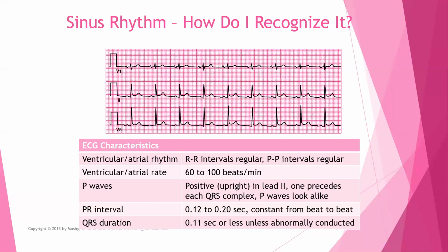So remember, sinus rhythm, the name says it all. That's the name we've given to a normal heart rhythm. It's sometimes called regular sinus rhythm, sometimes normal sinus rhythm, just sinus rhythm as well. And that represents normal electrical activity, right? So that conduction that is initiated at the SA node heads down through that normal conduction pathway through the atria, stops at the AV node, and just gathers up steam, and then down through the bundle, the right and left bundle branches, and the Purkinje fibers.